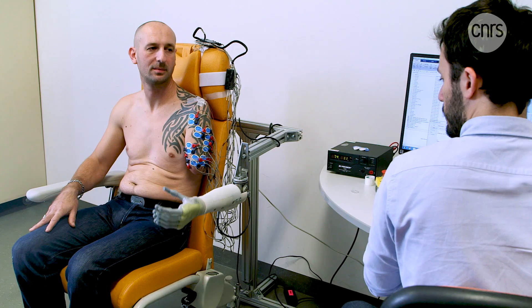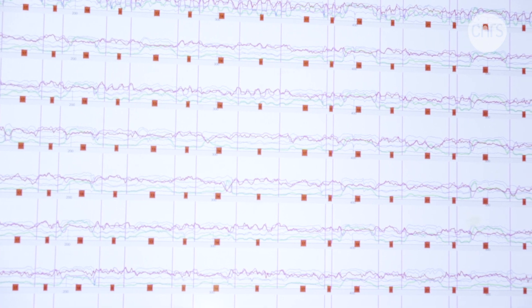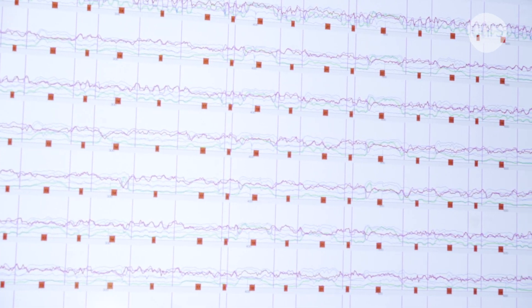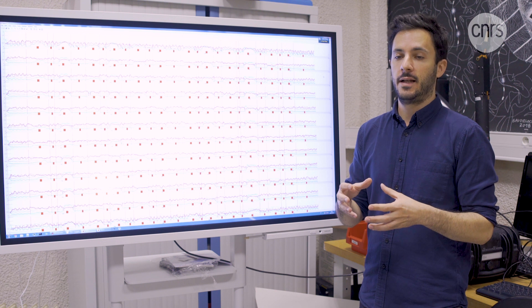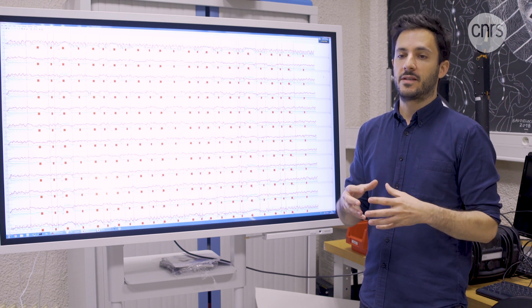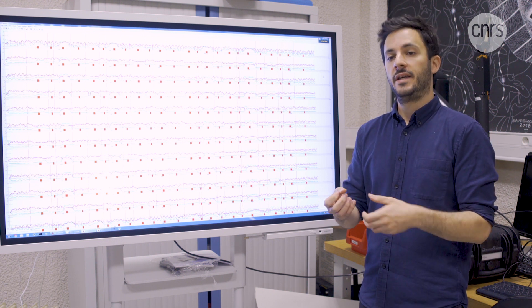Can you lift the elbow? Open the hand? Relax? Make a rotation for me? The main objective of this project is to create algorithms capable of decoding what the phantom limb is doing in real time, and follow its movement simply by reading the muscular contractions in the residual tissue. What you can see on the screen are recordings of the data gathered from the participant. We placed electrodes along his residual limb and recorded them as they carried out a certain number of phantom movements. We'll enter this data into a self-teaching algorithm which will personalize itself to this individual, including learning what kinds of muscle contractions correspond to what phantom movements — it will be enough to adequately control the prosthesis.